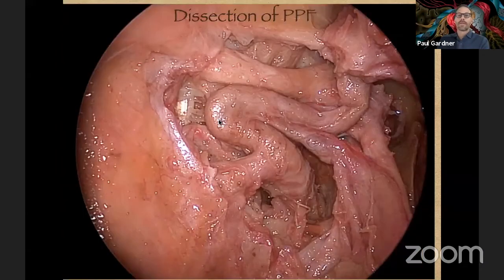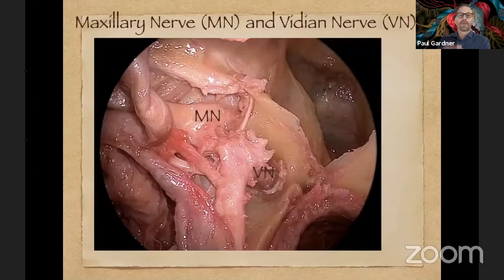Here we see a large IMAX branch. This can be coagulated or dissected laterally. And here we see the infraorbital branch and then descending palatine, which will be critical to preserve if we want to preserve palatal sensation. This is a view more from a medial approach.